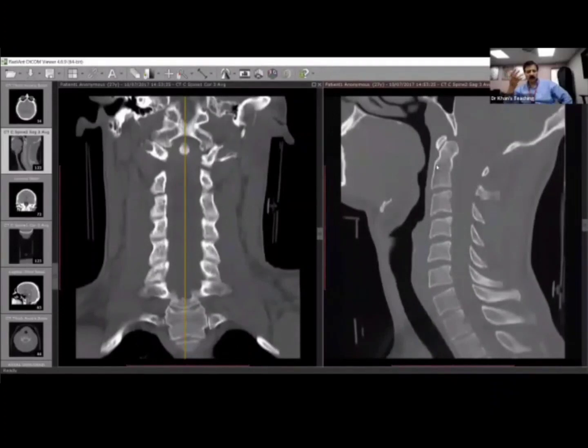I have the condyle, the orbital floor, subtle findings of subdural. All of these are important. But if a case is a gross case, then there will be discussions and viva questions and things like that. So you've done well overall, and particularly the last case you picked up very well.